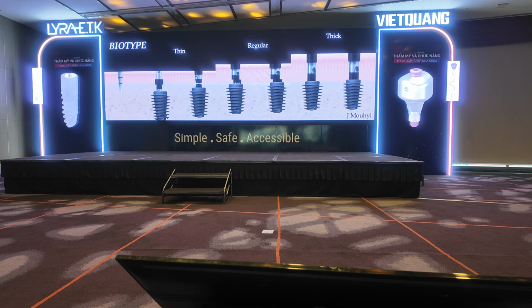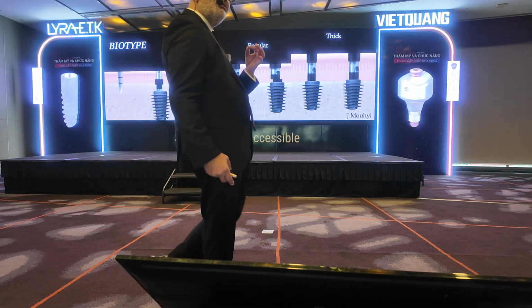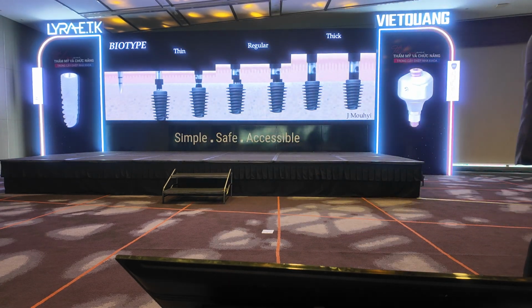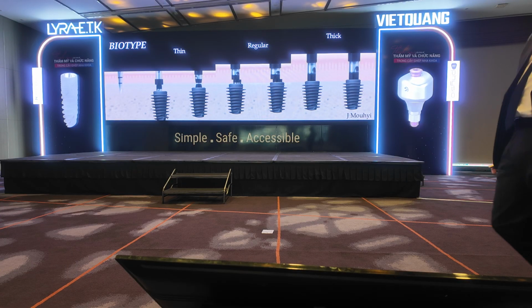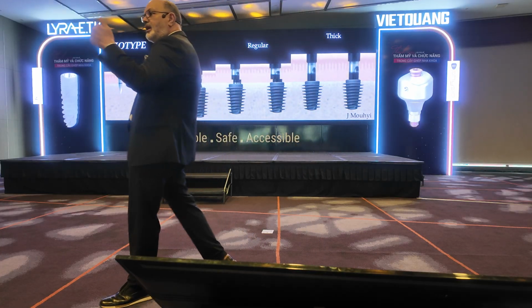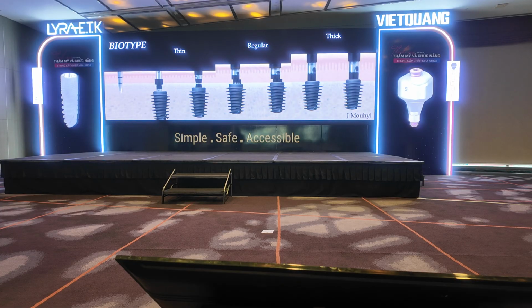It means that we replace the knowledge of the dentist by giving the right possibility to think of all those parameters in order to place the implant. So it's not only a guide to put the implant tridimensionally. It takes into consideration the biology, the type of bone, and the biotype. Okay?